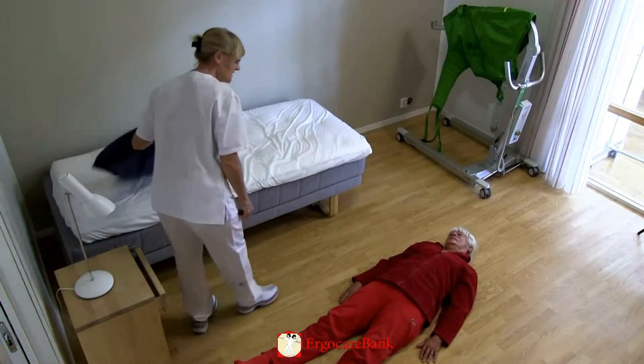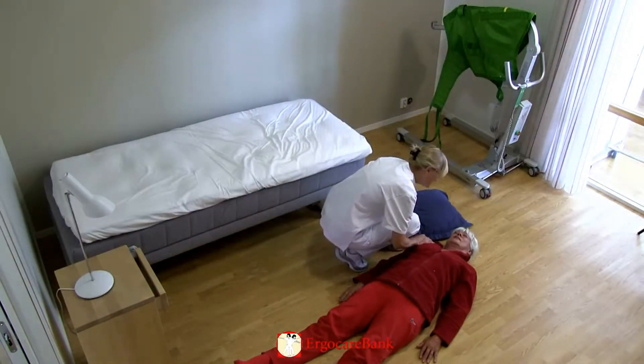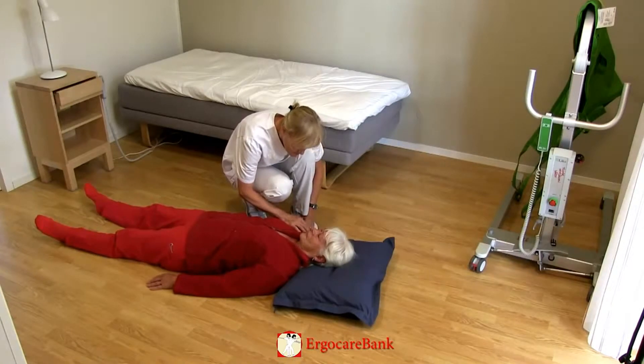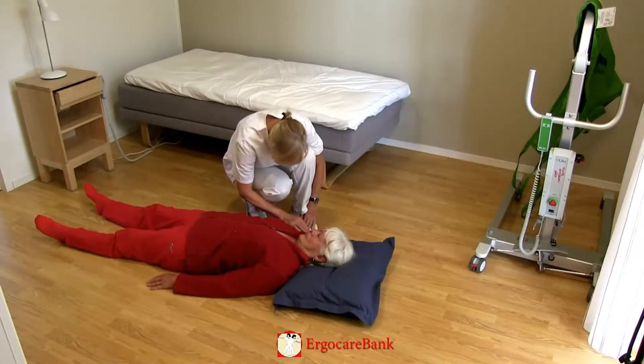Celia has fallen when getting out of bed in the morning. She is lying on the floor on her back. The staff member examines Celia to check if she is injured, then brings her a pillow and helps her to calm down.